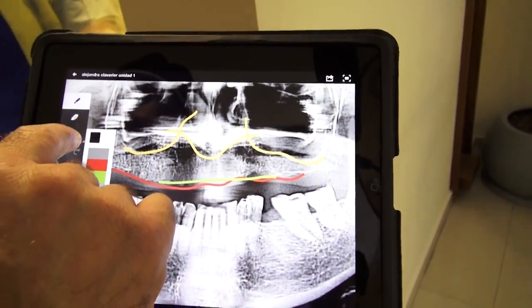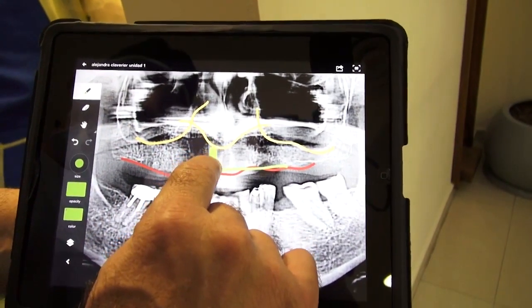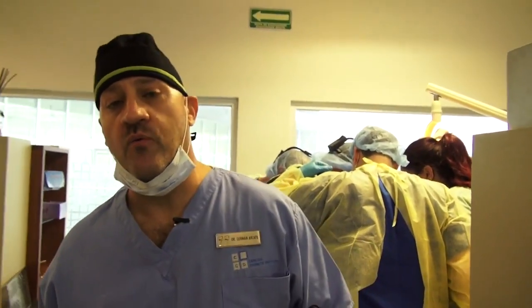The procedure is: we're going to do bone leveling and place six implants in this area — one, two, three, four, five, six. This procedure takes around one hour because we need to have parallelism between those implants. We're going to leave them there for at least three months for osseointegration.